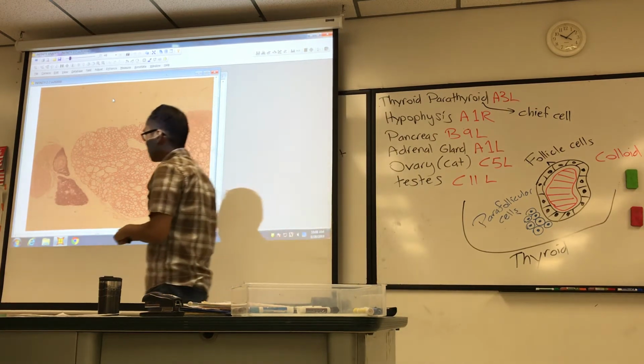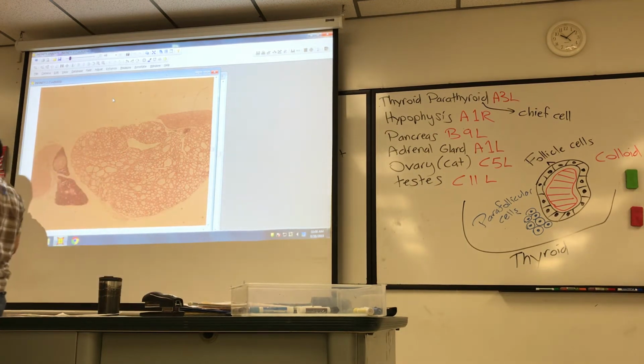The chief cell secretes parathyroid hormone. That should be in your notes from Monday, the first class. So let's go to high mag. I'm going to turn the lights off.